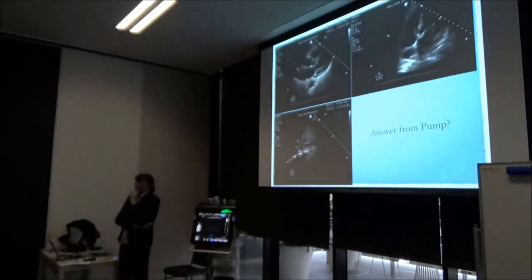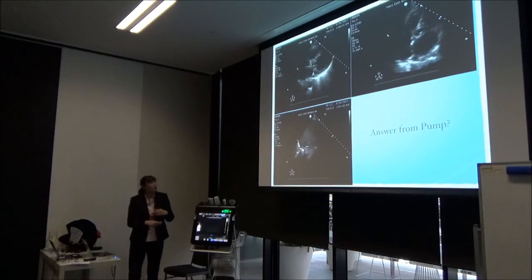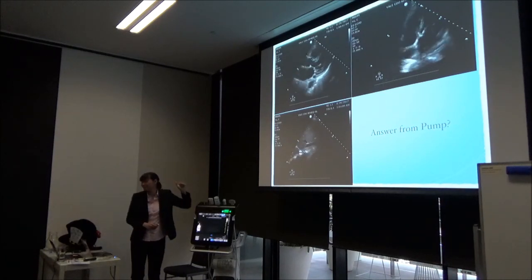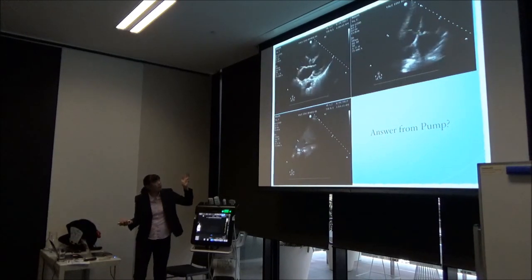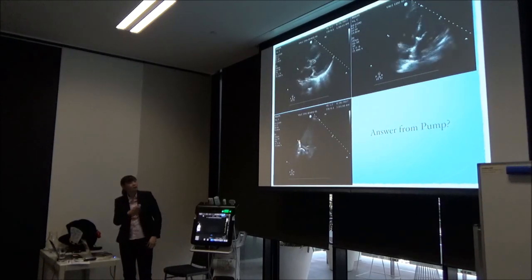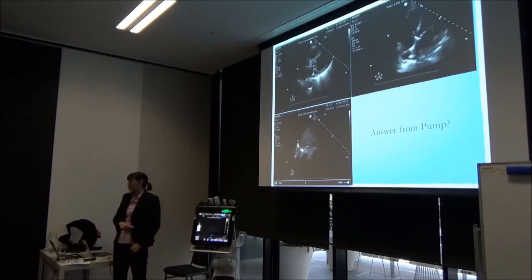As Arun said, I rarely do isolated lung exams. We do something called the focused chest exam, where we start with the pump first. If I don't have a great answer, then I'll move on to the tank. So, not bad for 90 years old, I gotta say. Effusion? No. Ejection? Good, right? Equality? Not bad. Exit is pretty normal, I think. And what about entrance? Is the IVC dilated or flat or neither?